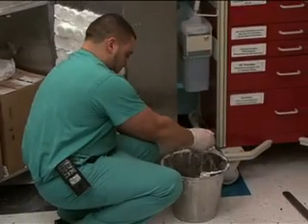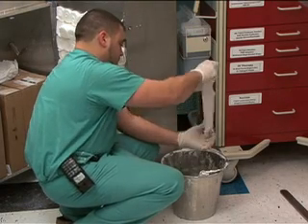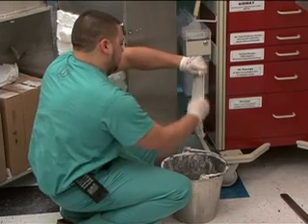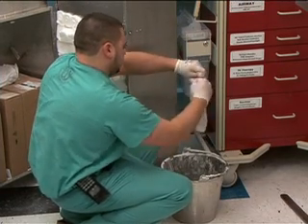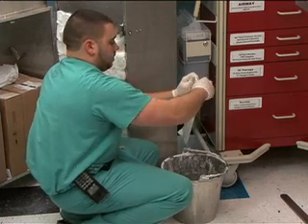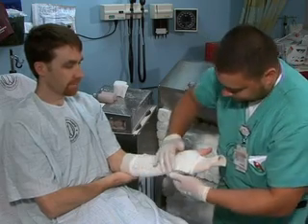Fill a bucket with lukewarm water less than 50 degrees Celsius and immerse the plaster material until it is saturated. Hold the wet plaster sheets vertically over the bucket and use 2 fingers to manually compress the layers in a downward motion. This removes wrinkles and excess water and will laminate the layers together. Place the plaster material over the cotton padding.